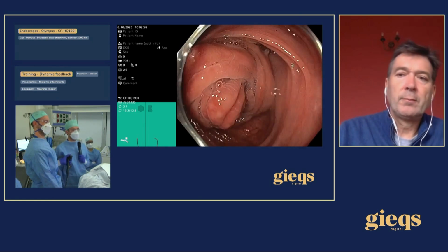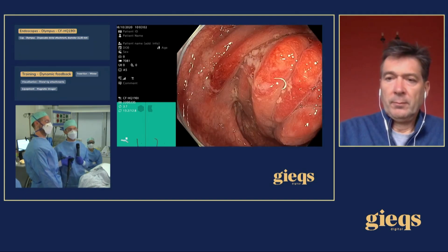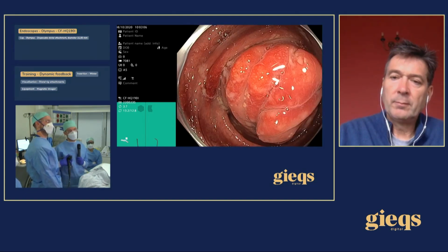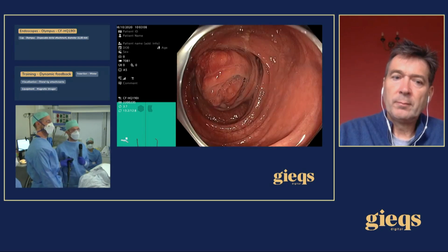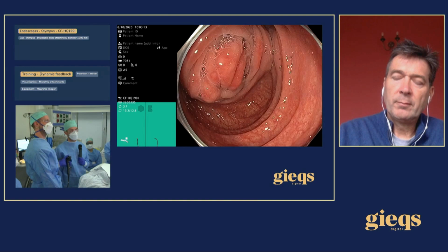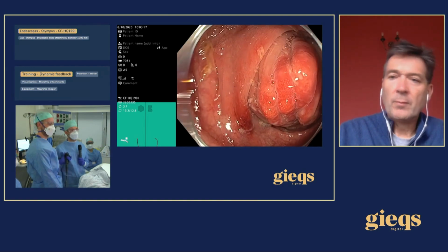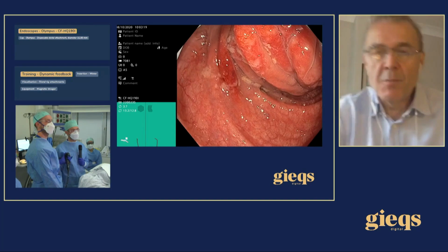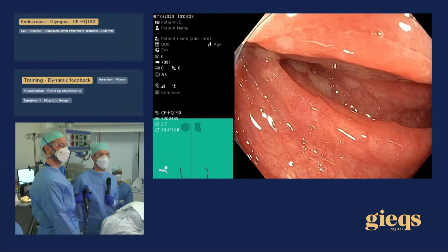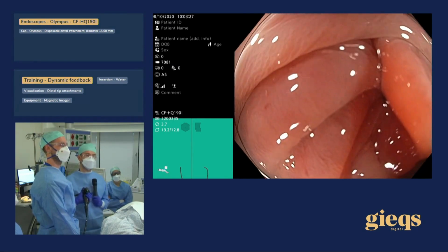And of course, there's something else we should probably be thinking about now, Christophe, or something else you're thinking about? Well, I think we should biopsy this lesion. Well, not the lesion. That for me is a typical appearance of mucosal prolapse. Around it, you can see multiple diverticuli. Would you agree, John and Roland? Yeah, it's a bit difficult. Our image is quite small, David, so... Okay, your image is too small. Okay. So from the endoscopic image, we can see that. But it's something in terms of progression, Christophe.